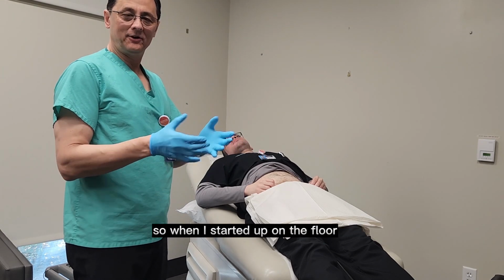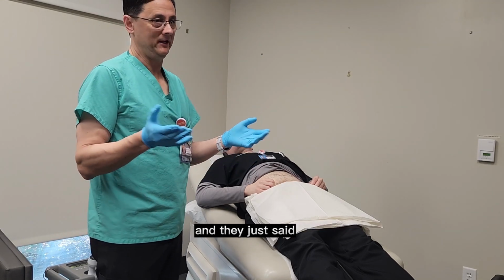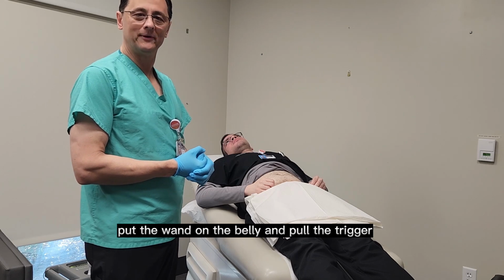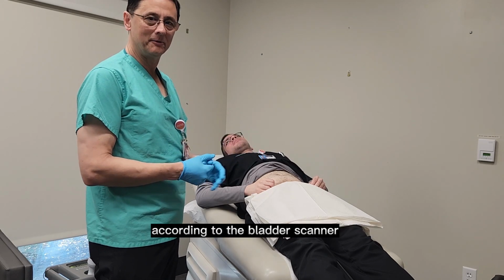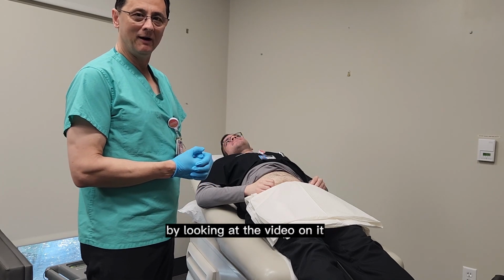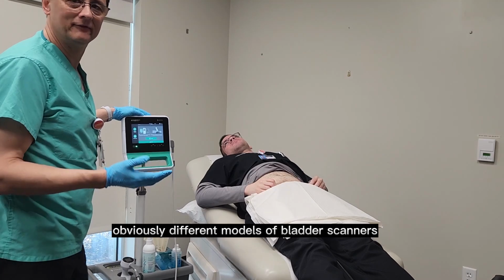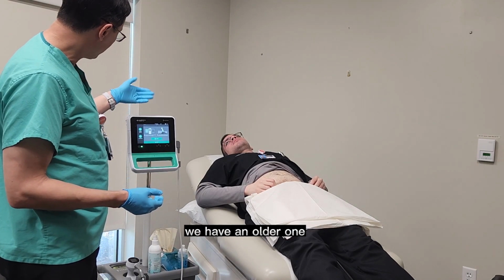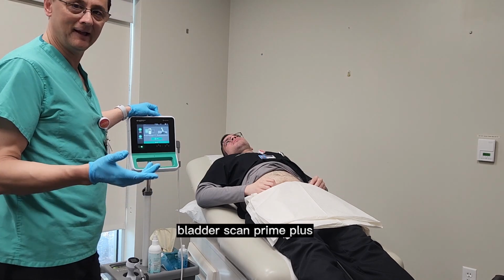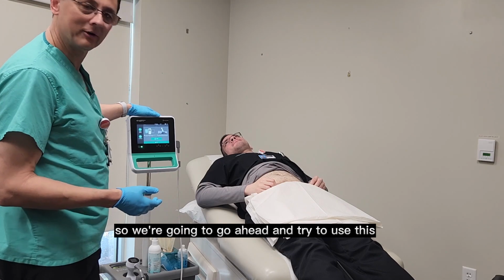When I started up on the floor, nobody showed me how to properly bladder scan anybody, and they just said, put the wand on the belly and pull the trigger. Well, I actually learned how to do it the right way according to the bladder scanner by looking at the video on it. Today we have different models of bladder scanners, and of the two that we have in the office, we have an older one, and then we have this Bladder Scan Prime Plus. This one's kind of fancy. It has a nice looking screen here, so we're going to go ahead and try to use this.